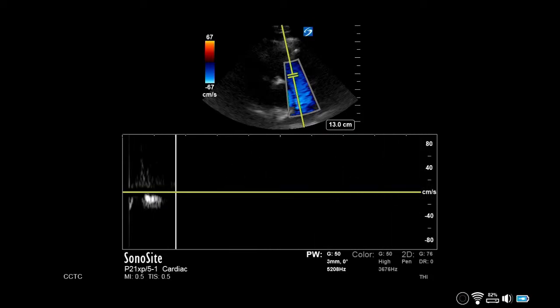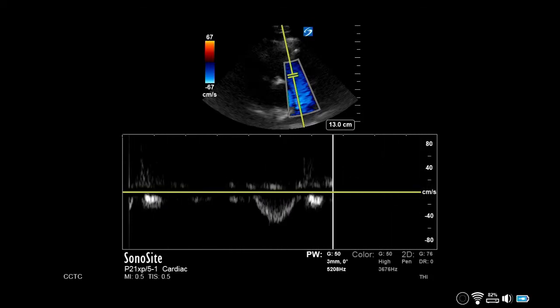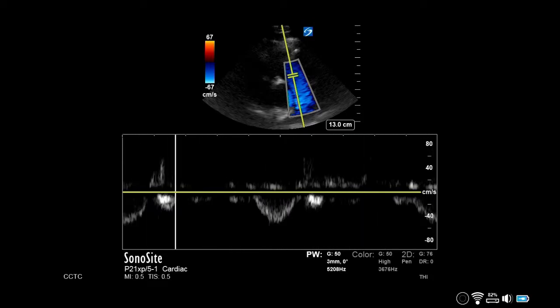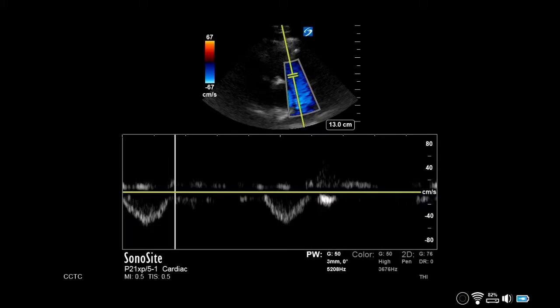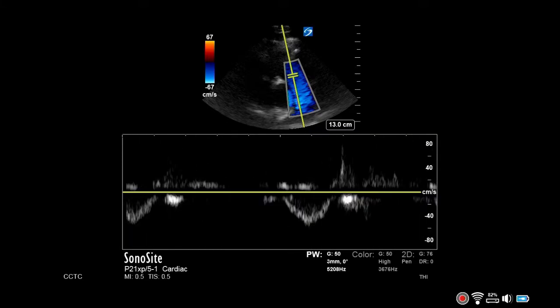Increase the sweep speed to at least 100 mm per second or faster to best visualize the peak systolic velocity. When an adequate envelope is visualized, freeze the image.